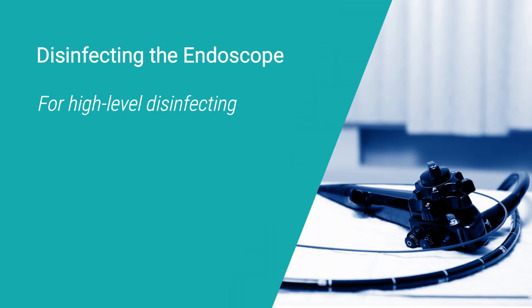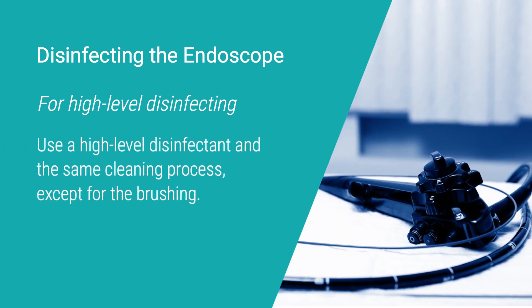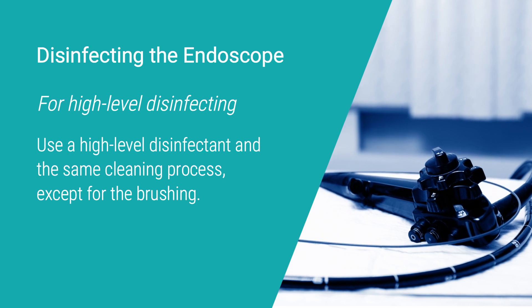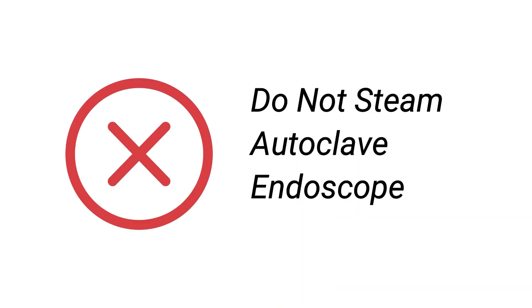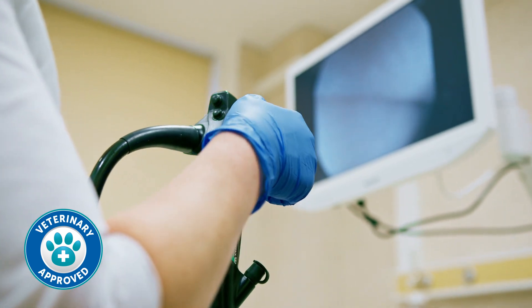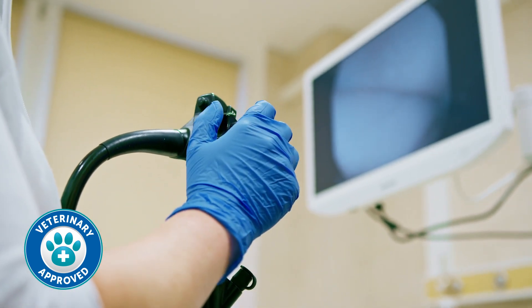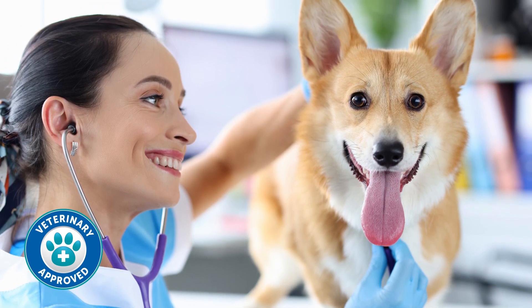Disinfecting the endoscope: if high-level disinfecting, use a high-level disinfectant and the same cleaning process, except for the brushing. Follow the manufacturer's instructions for soaking time. Do not let the disinfectant sit longer than the recommended time, as it could damage the endoscope components. Remember, never steam autoclave the endoscope, as it can cause damage. Use these cleaning steps to keep your endoscopes in excellent condition, ready for the next patient and procedure. Proper endoscope cleaning and maintenance are vital for the safety of your patients and the longevity of your equipment.